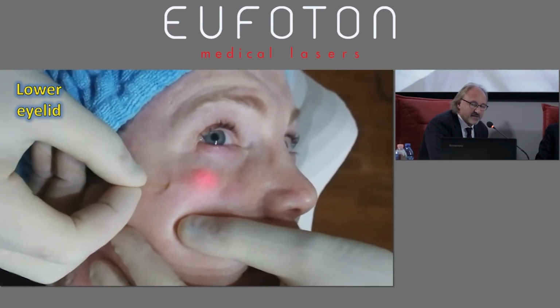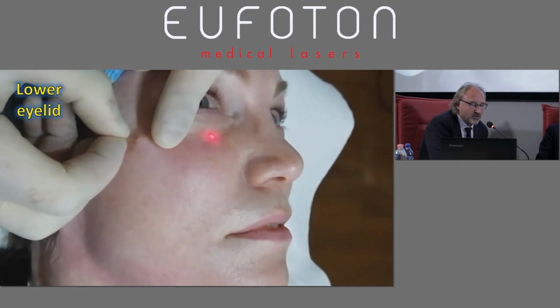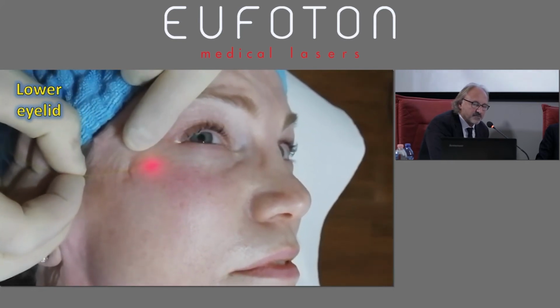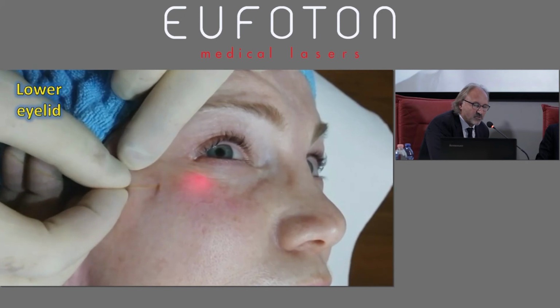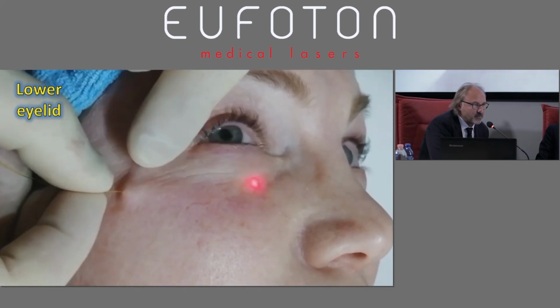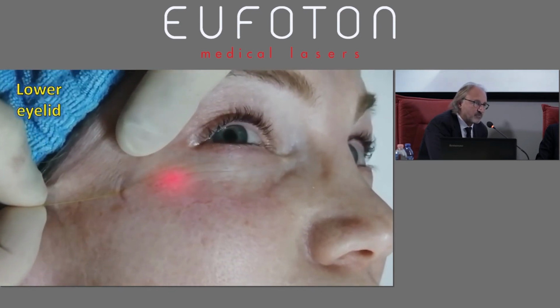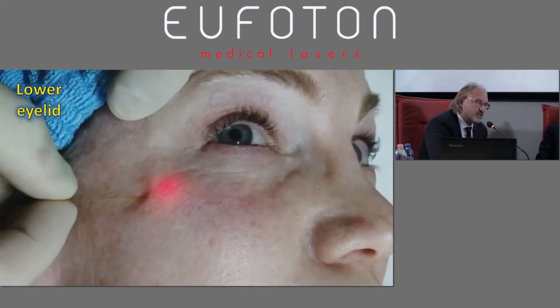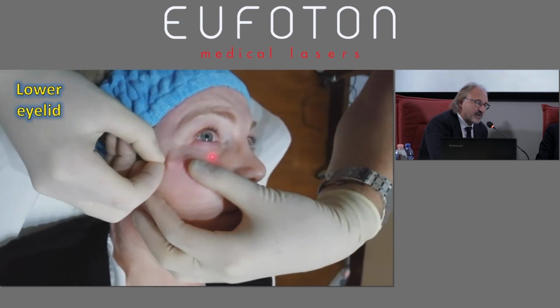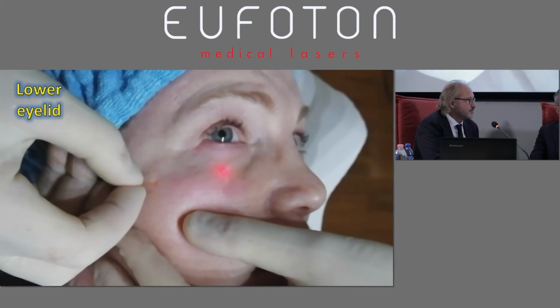You do more than this? So we have no clinical endpoint visible afterwards. The erythema shows quickly, you see some contraction. So I'm treating now the part with some laxity. For festoons, this works quite well, and I also have a good response for malar bags. You don't have real alternatives to choose.